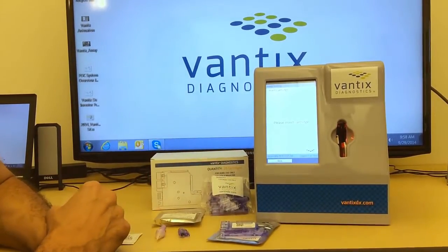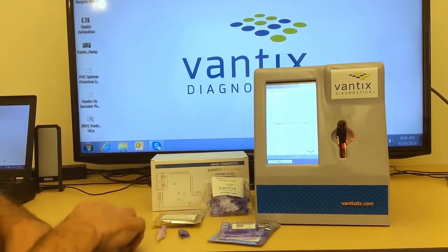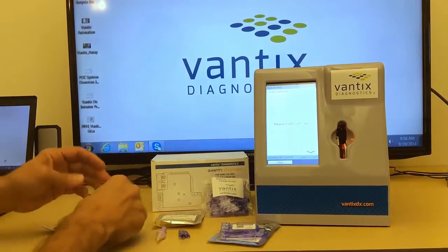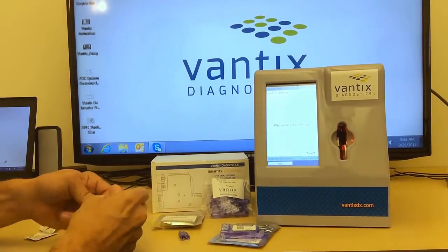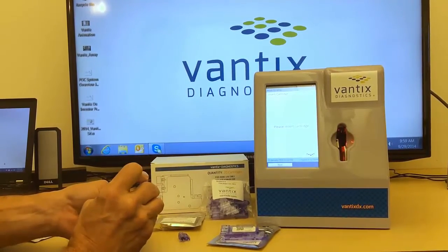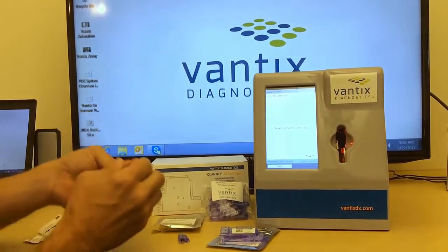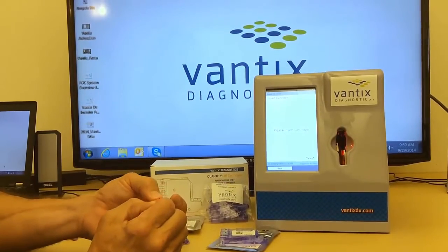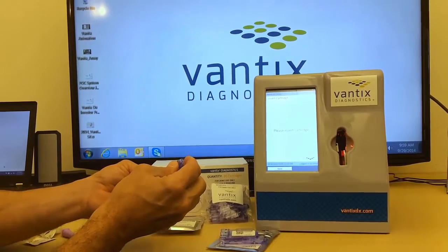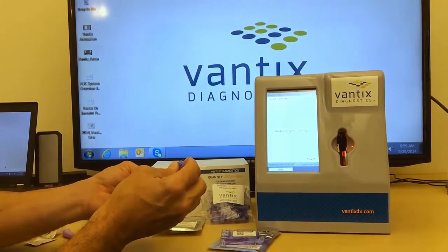Now the reader is going to ask me for the cartridge. The way we prepare a cartridge is we take the lancet and do a simple finger stick blood sample. The sample is collected in the capillary tube in the sample transfer device.